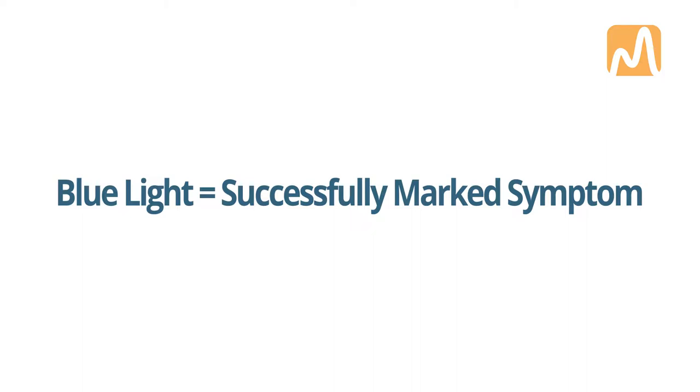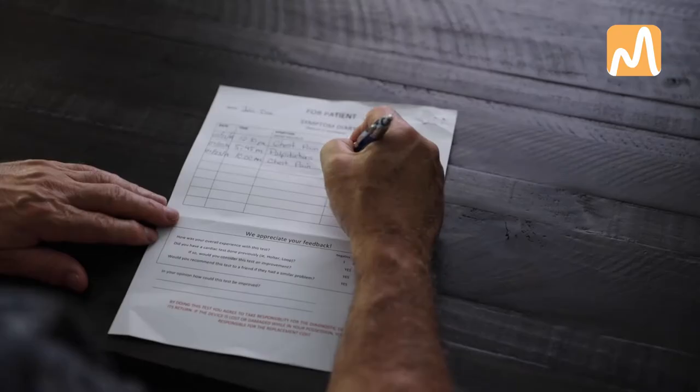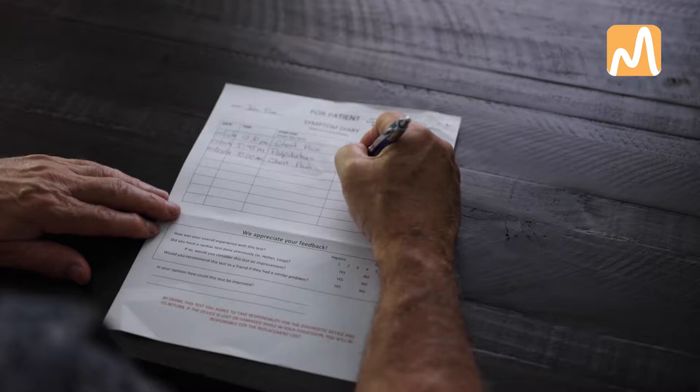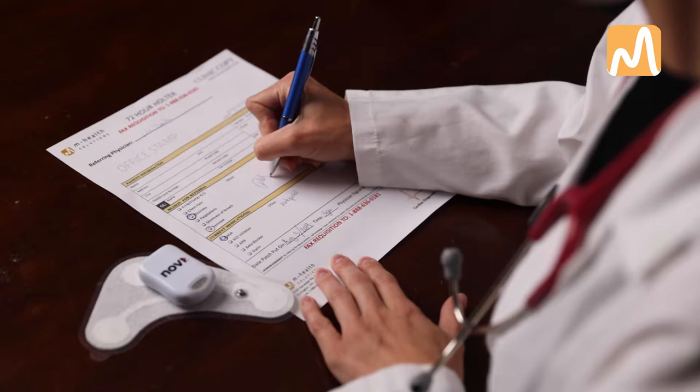If you want to confirm that you've done this correctly, you can always look in a mirror or simply look down at the monitor. After you have double-tapped on the device, you need to record the symptom you just felt. Please write these on the symptom diary provided by your doctor. On the form, you need to write down the date, time, description of the symptom, and activity you were doing at the time you felt it. This important information helps the interpreting cardiologists make a more accurate diagnosis.